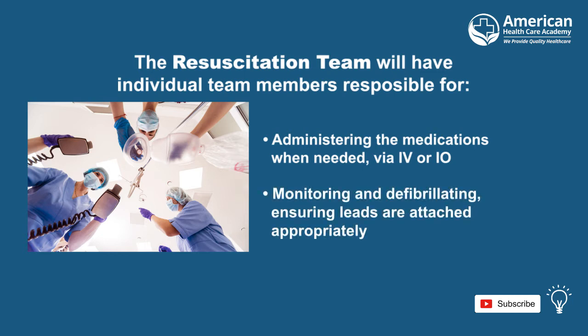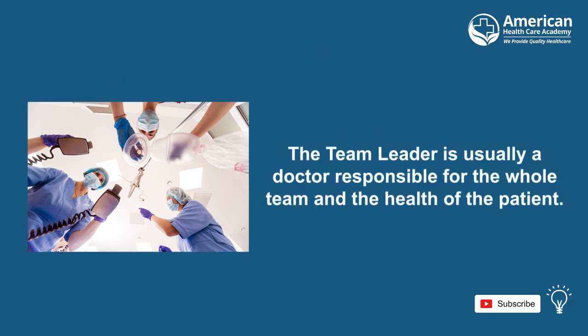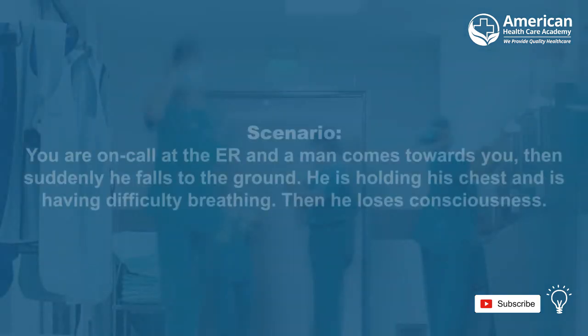Another team member will act as monitor and defibrillator and is responsible for using the defibrillator and ensuring leads are attached appropriately. The team leader is usually a doctor who is responsible for the whole team and the complete health of the patient. Let's take a look at a scenario.